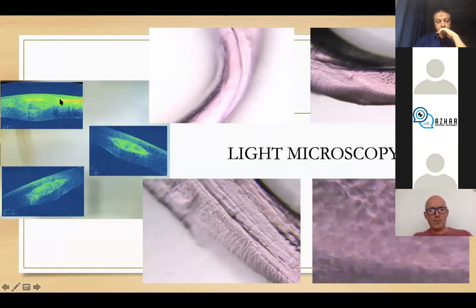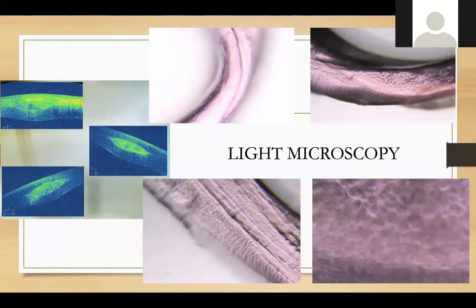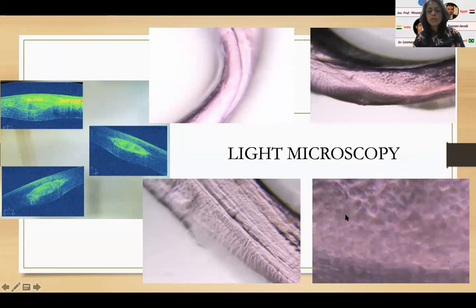However, this is a patient post keratoconus and CAIRS, where you can see the implantation of the segments at 50%, and a very good, quiet-looking anterior segment OCT with no inflammation or any other kind of reaction seen around the segment. These are the light microscopic images, again seen here, which show you the very parallel and well-organized structure of that CAIRS segment with the good organization of the corneal fibers.